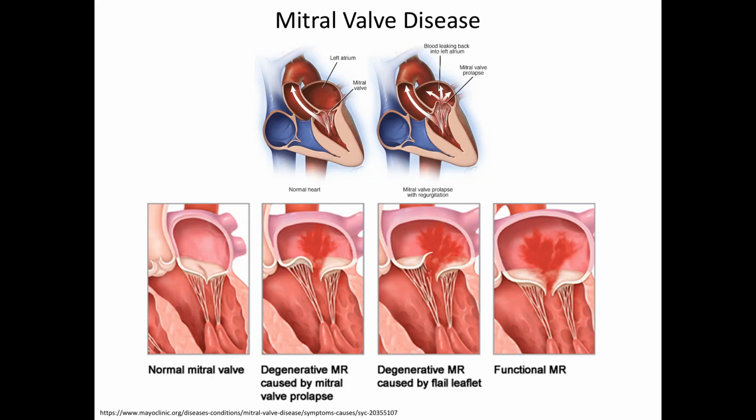It's open for a while, but it's a little divot that you can find and then poke right through, right? And so planning that route with your implantation device is often guided by ultrasound.